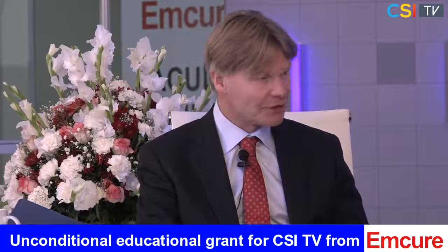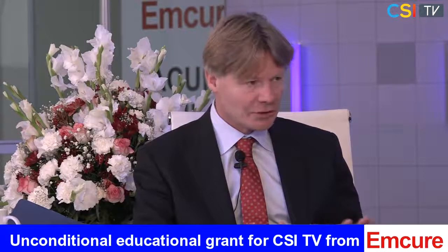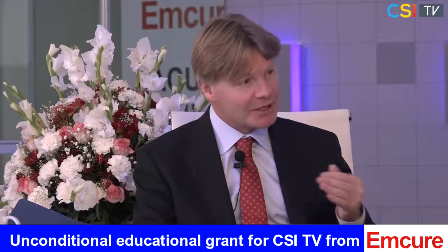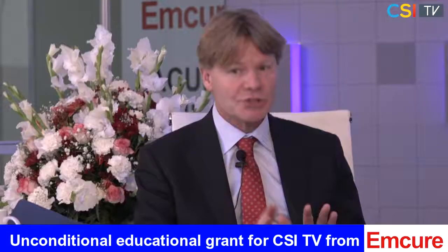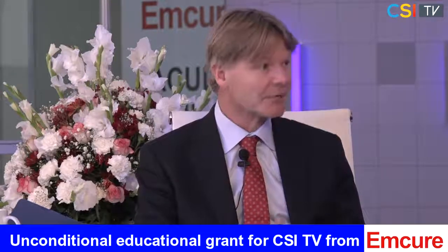Okay, so the calcium score is the easiest way of looking at the CT scan. You just look at the amount of calcium present. You started with the word asymptomatic, which is important. If you have symptomatic patients, you should not use the calcium score, because those patients may present at a very early stage of coronary artery disease and have non-calcified lesions, which may be, as you will indicate later, more vulnerable. True. So stable patients, either symptomatic or asymptomatic, you can do a calcium score as a first test. I think it's a very good test.